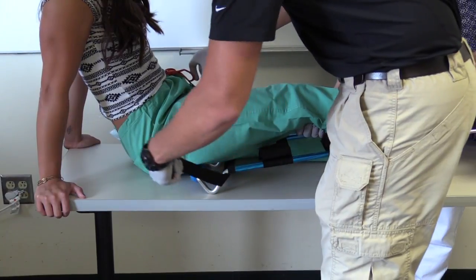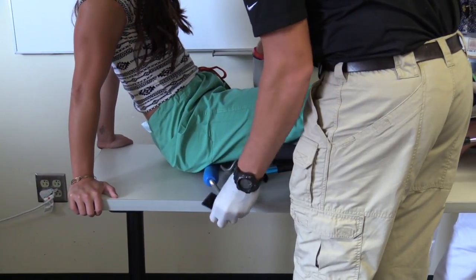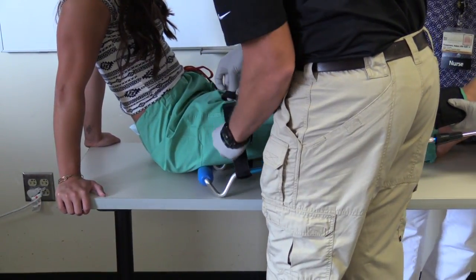I will place the device underneath the injured extremity and have my partner align the leg with the device. To secure the leg to the device, I will first secure the ischial strap.